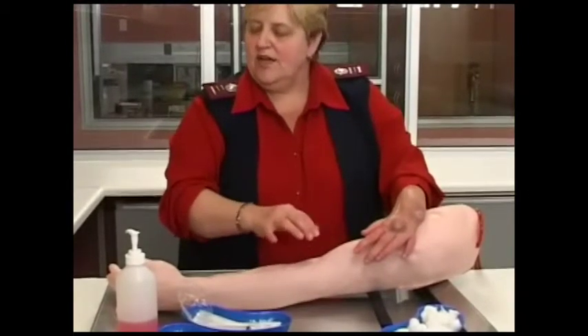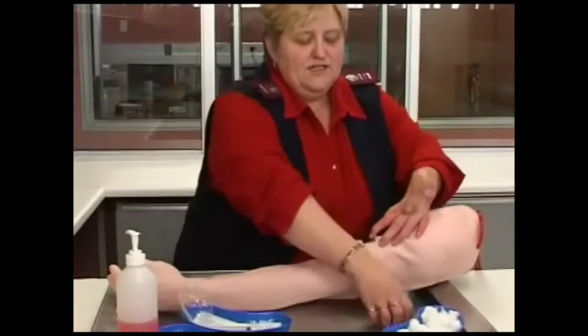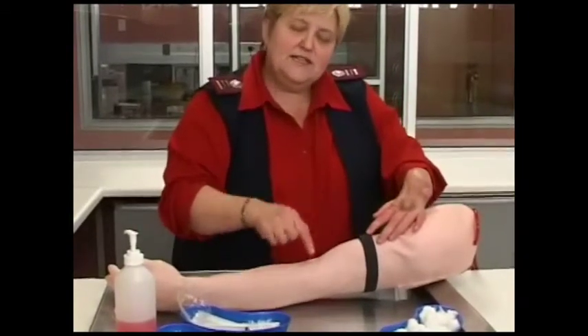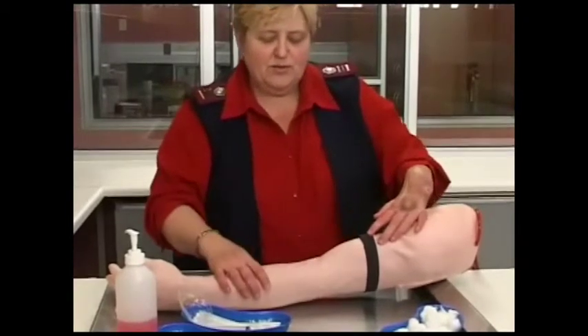While the area is drying, put on your gloves. The reason why we want it to dry is that it's alcohol-based, and if you insert the needle now, it's going to sting and be painful for the patient.